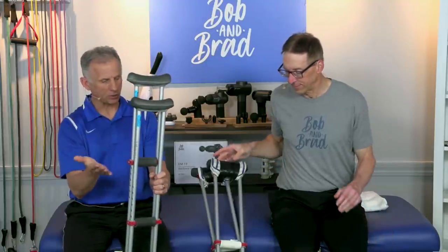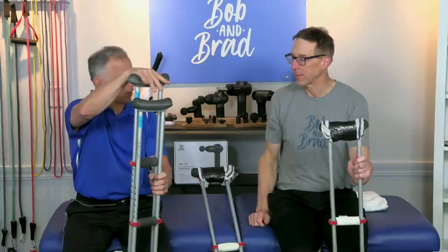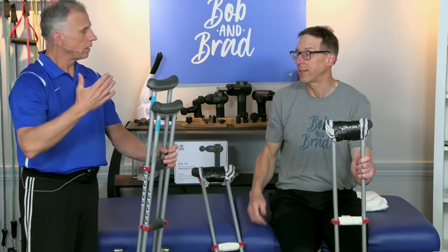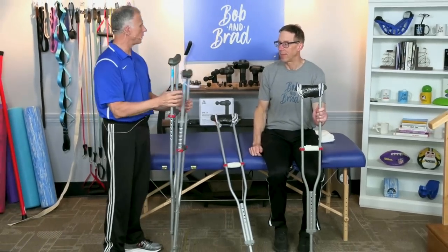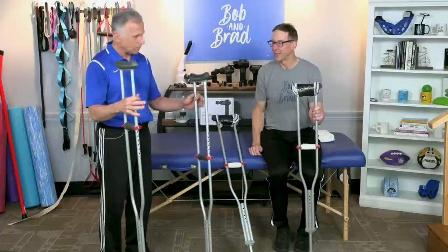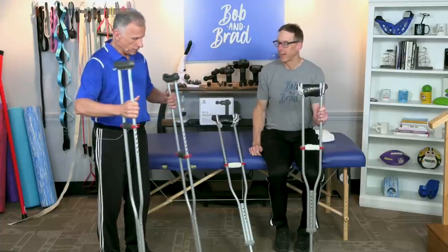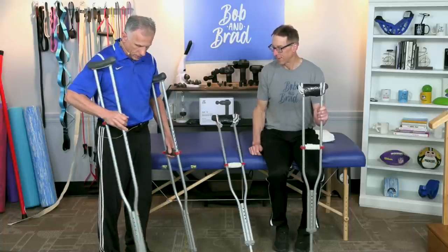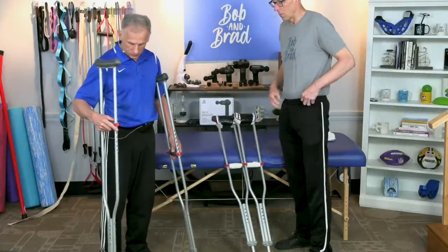If you need crutches, or know someone that needs them, the first thing you need to do is adjust them for the proper height — under the armpits as well as for the hands. It can really cause a lot of damage and discomfort if you're wrong. You can fall and irritate your brachial plexus — we'll talk about that — and cause hand soreness. So you take your crutches; typically most people have the aluminum ones. Put the crutch about six inches away from your toe at about a 45-degree angle out, and do that with both of them.